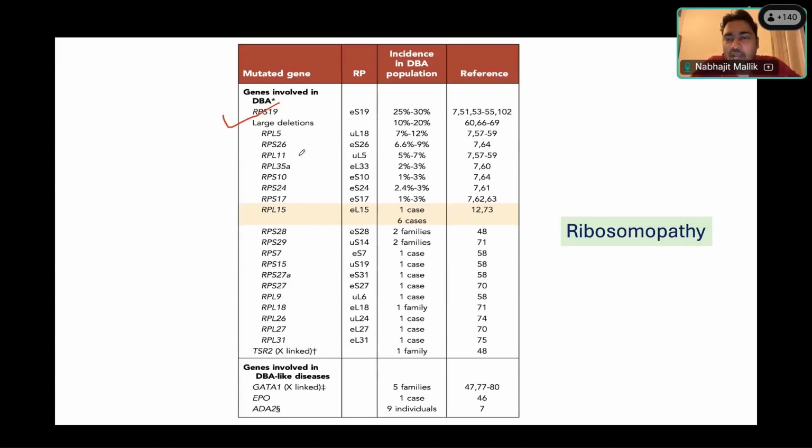And in the bone marrow, we have lineages of the megakaryocytes, we have lineages of the granulocytes and the erythroids, right? Which of them are the ones which are produced at the maximum numbers out of erythroids, megakaryocytes, and granulocytes? The turnover of the erythroids is the highest, right? The number of erythroids is so much more compared to your platelets as well as your leukocytes, right?